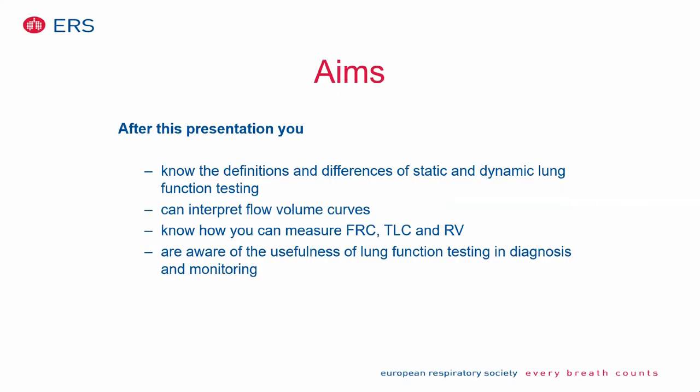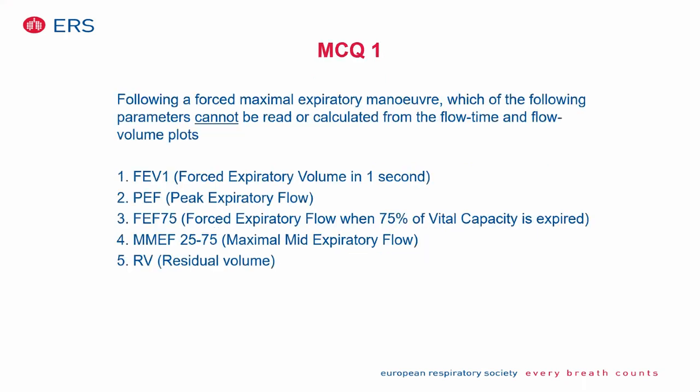And I hope to show you a little bit the differences of spirometry and bodyplethysmography in this talk. We'll start with the easy one, the spirometry, and then we go to the little bit complicated one, the bodyplethysmography. So I just start with a question that you can try to answer with a poll. It should be an easy one, just to see what's the background of the participants.